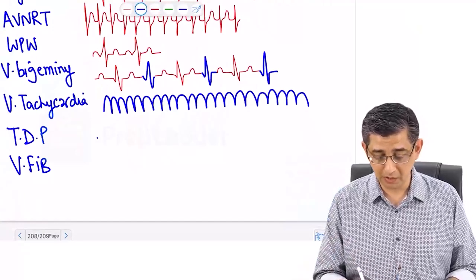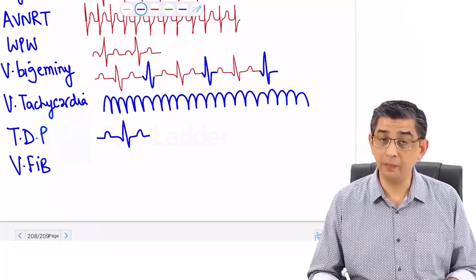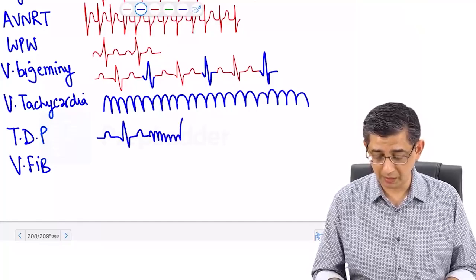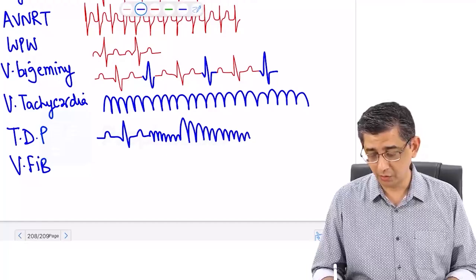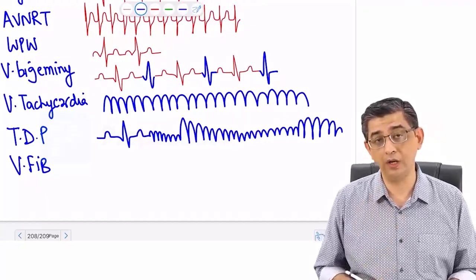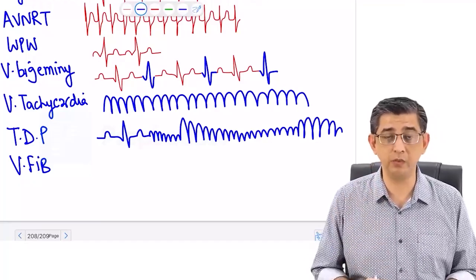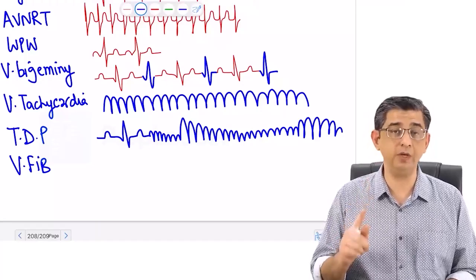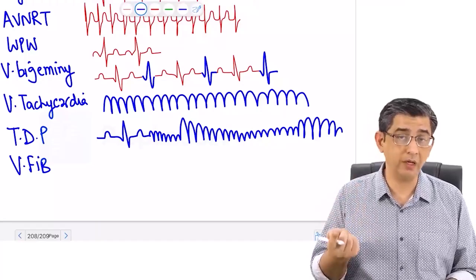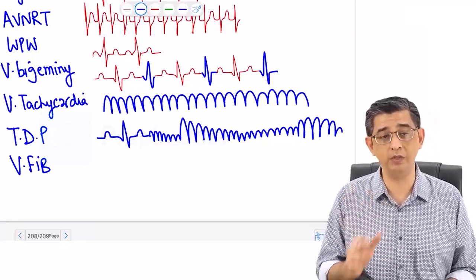And when it comes to Torsades de Pointes, then I'll just draw baseline rhythm. And once any electrolyte imbalance, hypokalemia, hypocalcemia, hypomagnesemia would start, you will notice that the sinusoidal pattern will be changing in amplitude. And therefore it's important, because don't mistake this with especially I would say electrical alternans, because in electrical alternans it will be a normal duration QRS whose voltage will be fluctuating, but here it is a broad QRS. I repeat once again, in electrical alternans, which is discussed in pericardial effusion topic and also in cardiac tamponade, you will notice normal duration QRS amplitude changing, but here it is broad QRS amplitude that is changing.